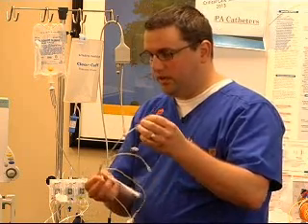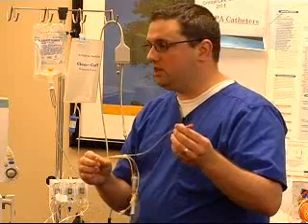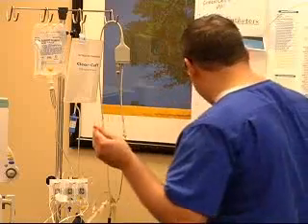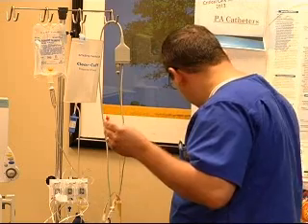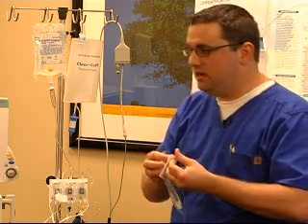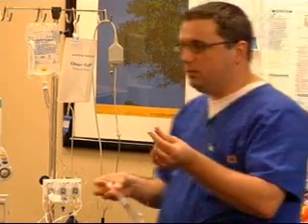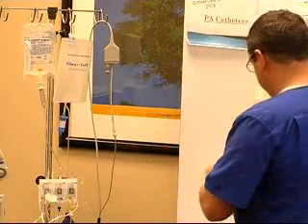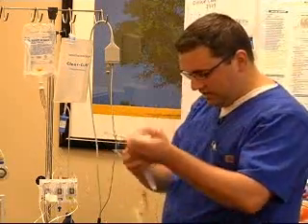This particular Swan is an RV Swan, or a pace port Swan, which will accept the Chandler wire we talked about in pacing earlier. The only other piece you need to remember to have with you, and this is why it's good to have a punch list in your mind of what you need, since the critical care box has all this stuff in it with the exception of the flushes, which they usually have in the room, is some kind of simple clave. The simple clave is for the RV port. And whenever you're going through and connecting these lines, say we're going to connect the PA line.